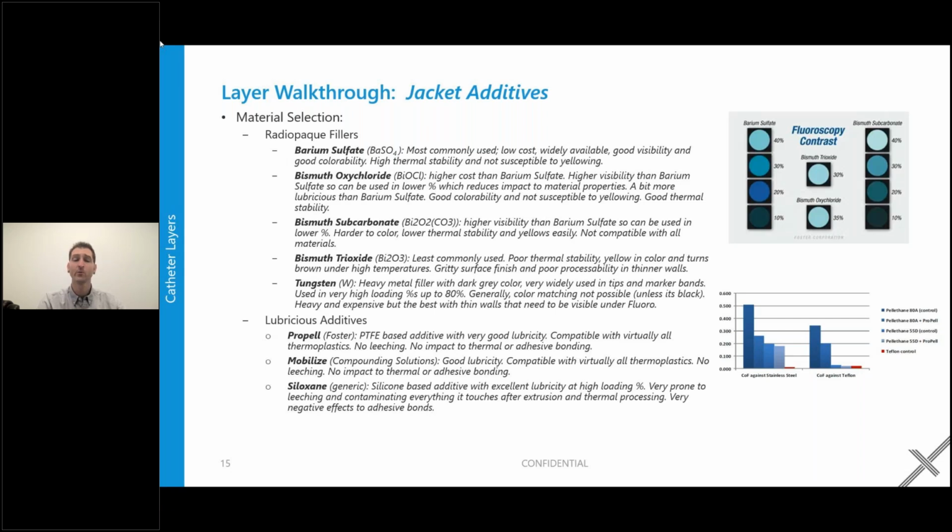Neither of them can really withstand typical reflow processes. So not great for outer jacket materials on a composite structure. Maybe you use them on just an extruded tube where you can extrude them a little bit colder and use them as a dilator or an introducer shaft.